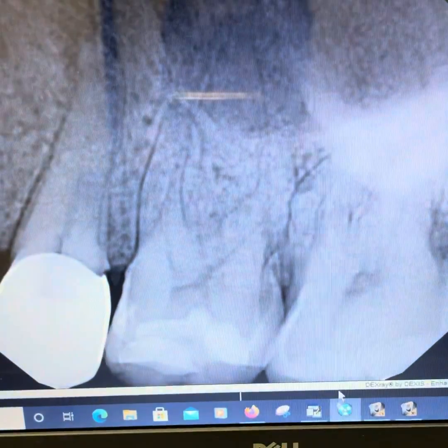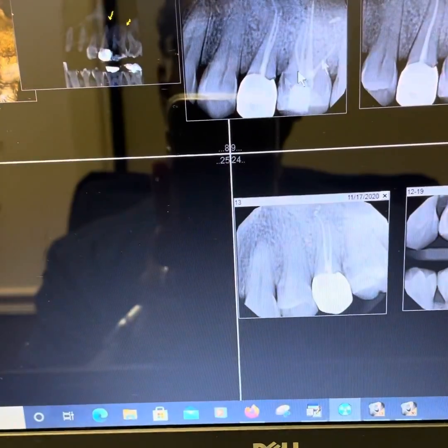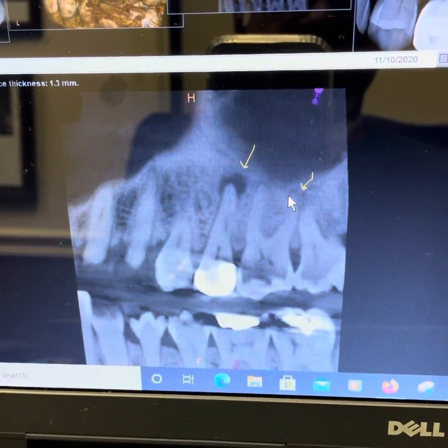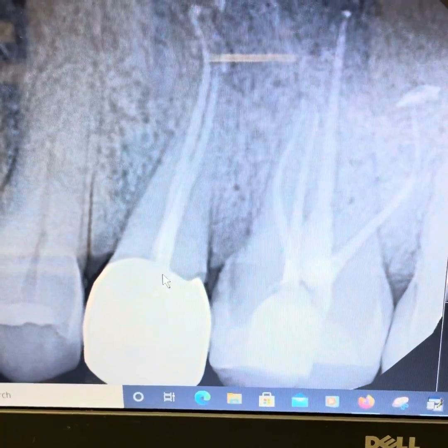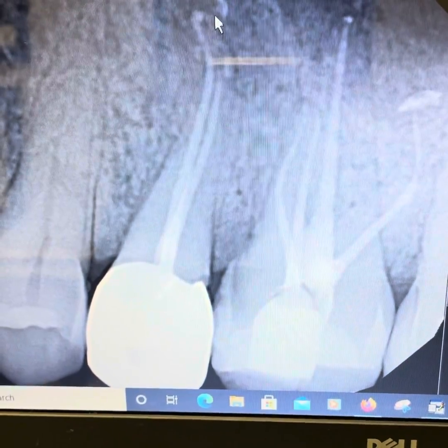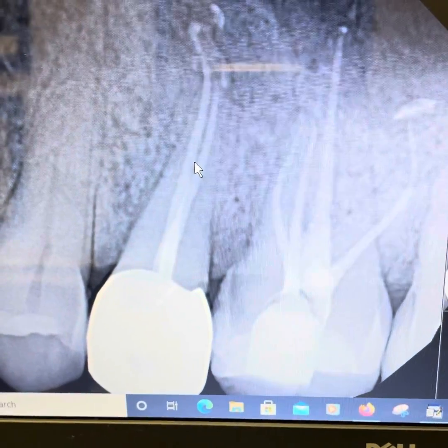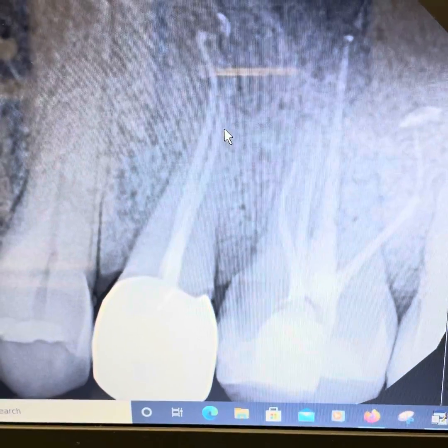Once we got the patient anesthetized, we were able to do treatment on both teeth, and you can see here the lesions that I pointed out to you earlier, and we completed the treatment. You can see tooth number 13 had 2 canals, some pretty tortuous anatomy here, and we used Avalon Biomed BC Sealer and gutta percha, and we also used EdgeEndo X7 04 heat treated files.